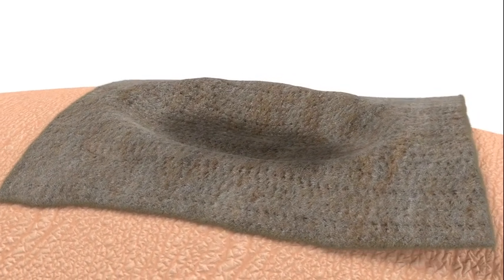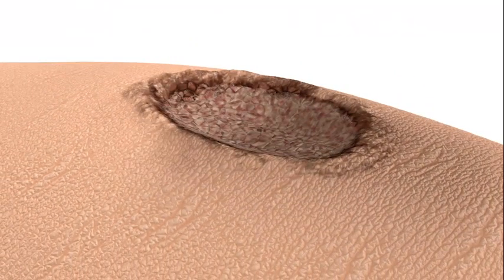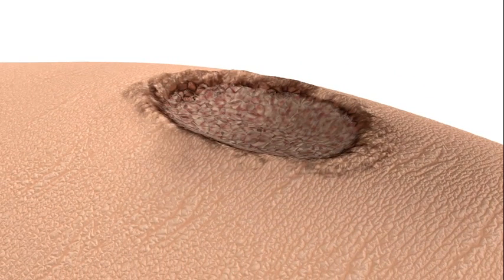During removal, the dressing stays intact and leaves no residue, which is especially important in cavity or deep wounds.